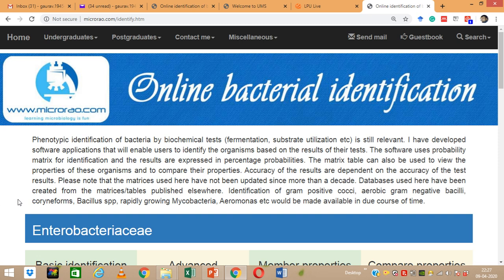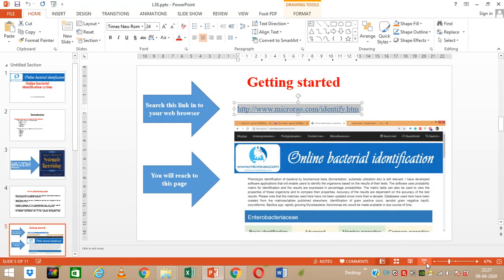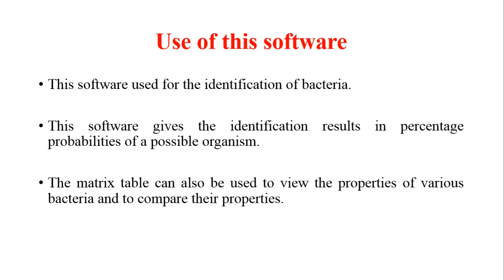The information on the homepage covers almost the same points already discussed. This online tool can be used for various purposes, with three major ones. First, it is used for the identification of bacteria, giving identification results as percentage probabilities of a possible organism — it will give you more than one result. While considering other parameters such as growth parameters, ecology, and isolation source, you can finally conclude your organism's identity.